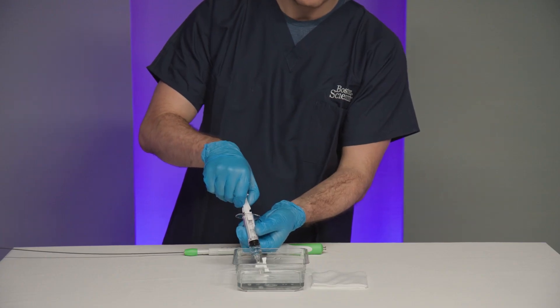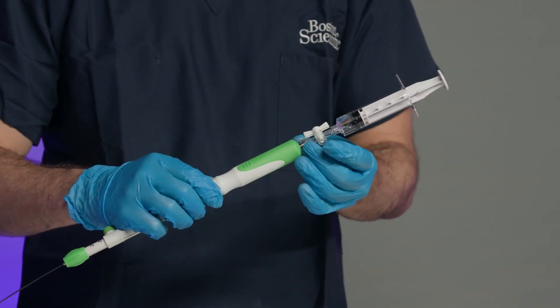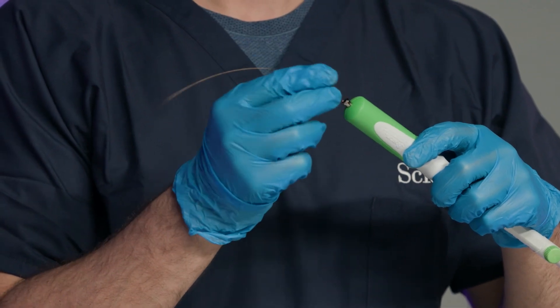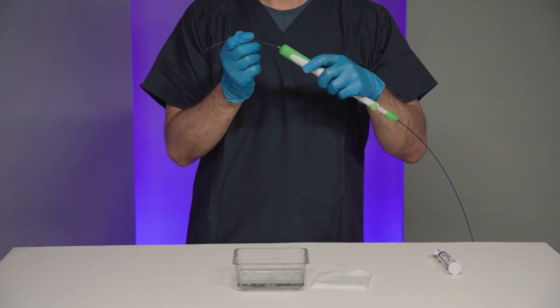If additional passes are required, prepare the device by flushing the needle and wiping the stylet with sterile water or saline. Reinsert the stylet into the needle, examine for damage, and repeat the previous steps.